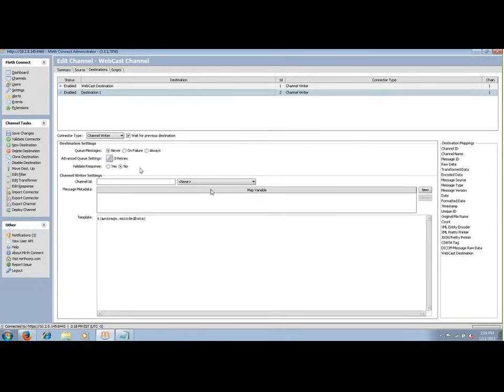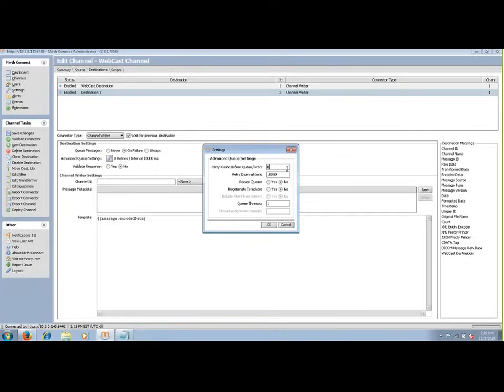Something I find great about MIRTH is within destination settings, there's an option to queue messages: never, on failure, or always. If we select 'on failure' and look at the advanced queue settings, we can define our retry count, retry interval, and a feature called 'rotate queue.' If a particular message exceeds the retry count with rotate queue set, that message will be rotated to the end of the queue and the next message will be allowed to attempt processing. I haven't really seen something like this before — usually if a message fails and is stuck in queue, you have to manually intervene by removing it.